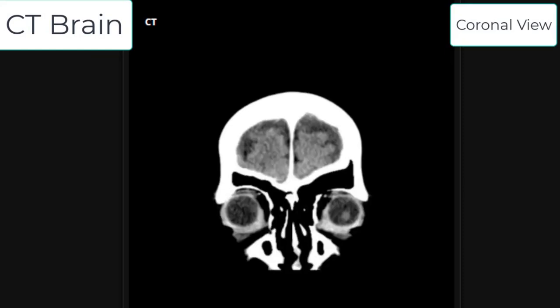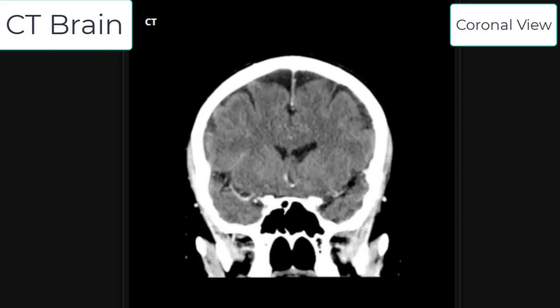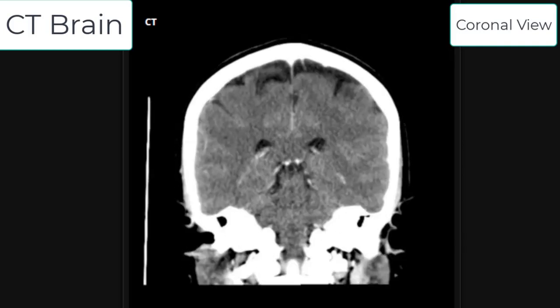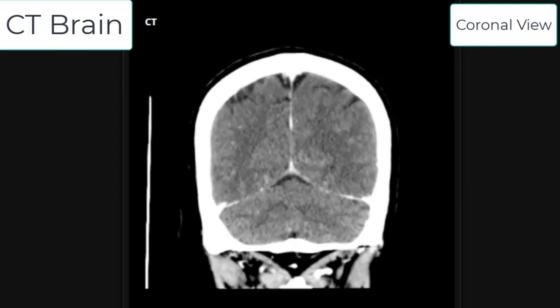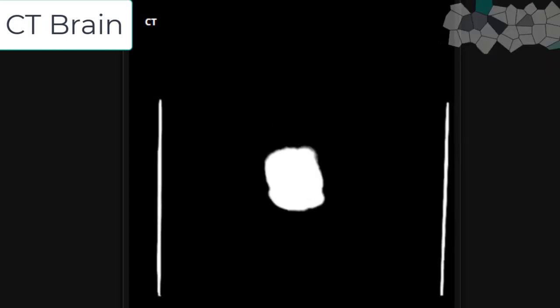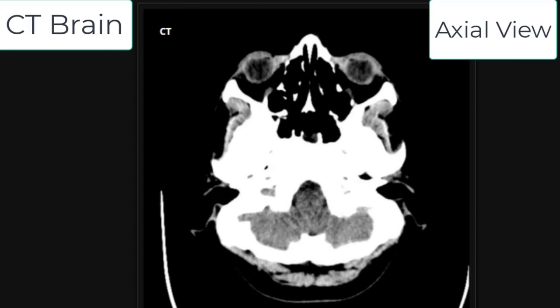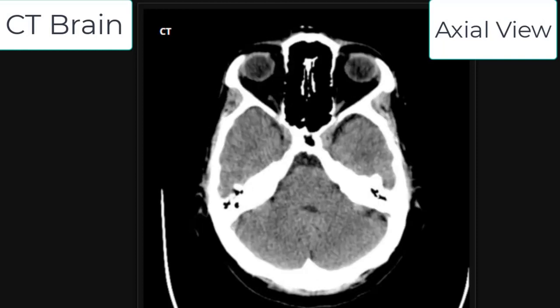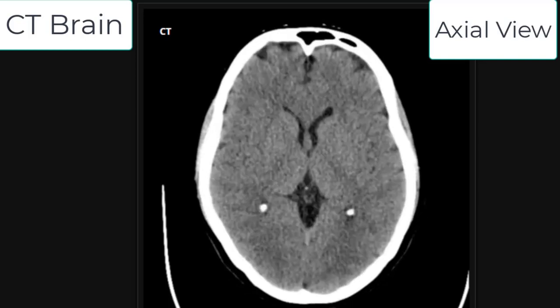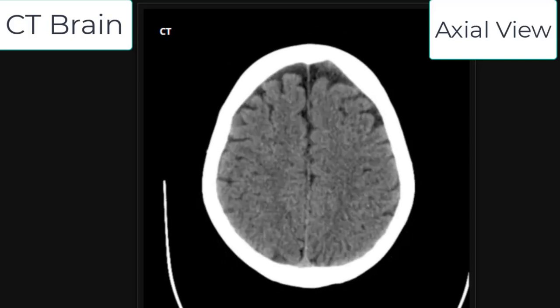This is the CT brain in coronal view, showing an anterior-to-posterior view with the outer bones, inner brain matter, outer gray matter, and inner white matter. This is the CT brain in axial or transverse view, showing the same structures. Importantly, this view also shows the ventricles inside the brain — this is a normal brain.